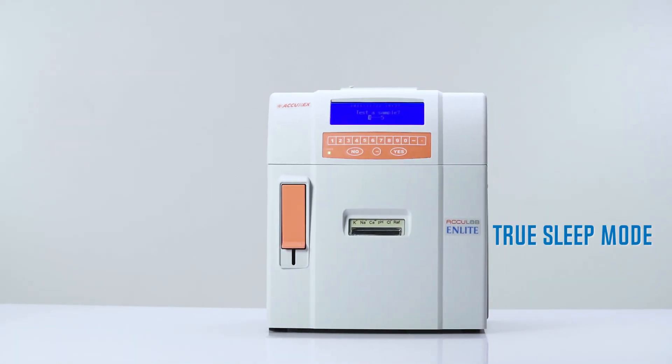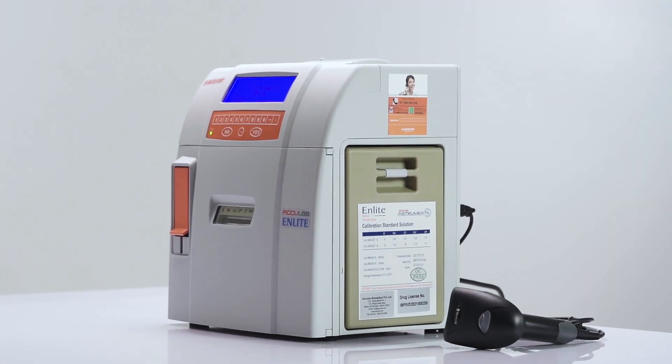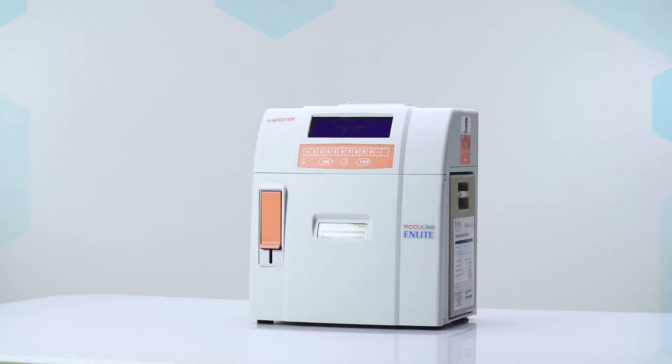A true sleep mode feature provides for manual programming of sleep time, during which no reagents are consumed, leading to optimum reagent usage for testing.